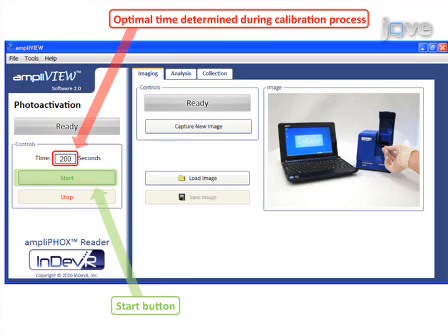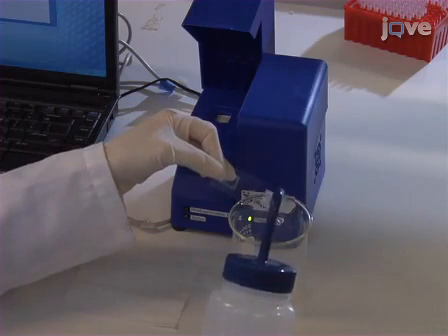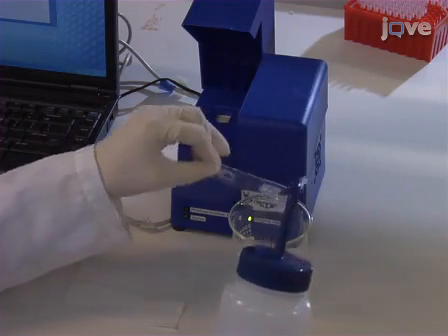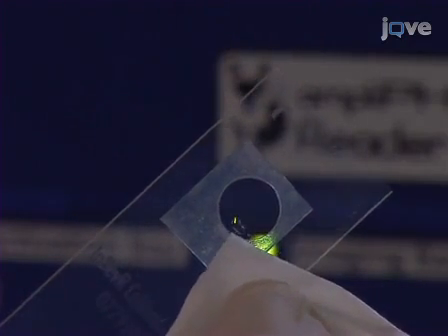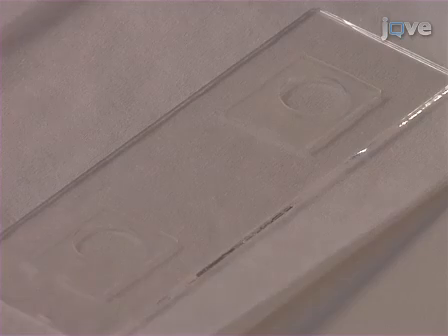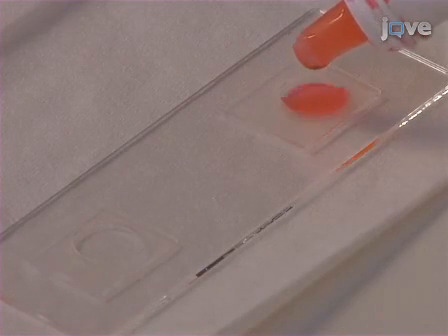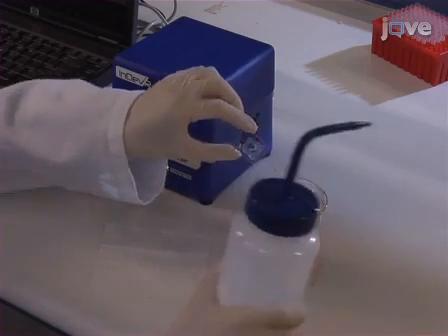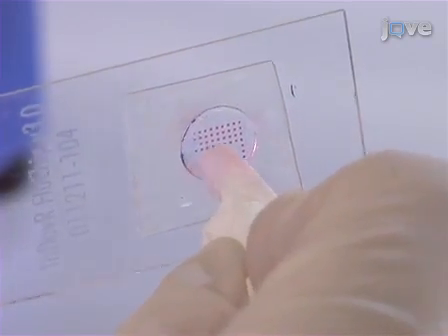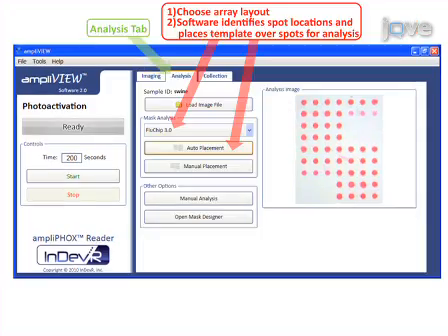Start photo activation by selecting Start in the AmpliView software using the photo activation time determined in the calibration process. Once completed, rinse the microarray with 2 milliliters of purified water to remove excess AmpliFY. Clear polymer formation has now occurred on spots containing target DNA, but is better visualized after staining. Allow the polymer spots to dry for 2 minutes, then distribute 2 drops of AmpliRed onto the array and allow staining to proceed for 2 minutes. After staining, quickly rinse the slide with purified water, dry, and insert the slide into the imaging bay of the AmpliFox reader to collect an image using AmpliView software to process results.